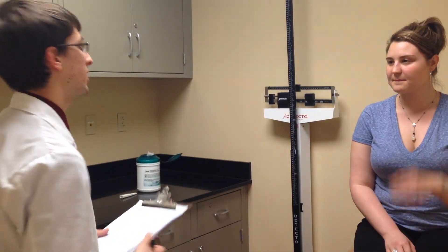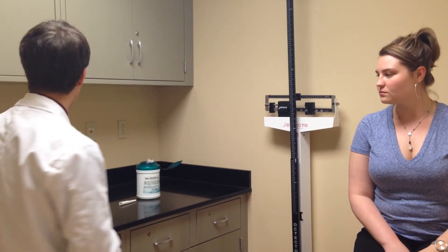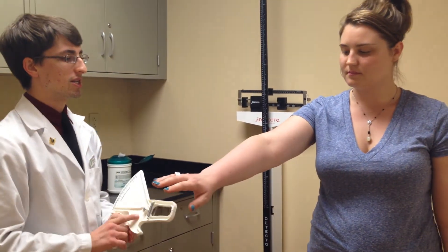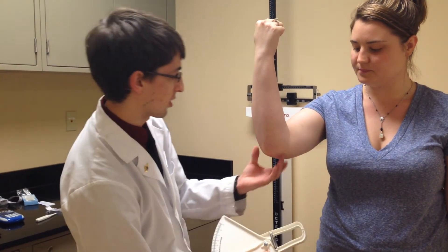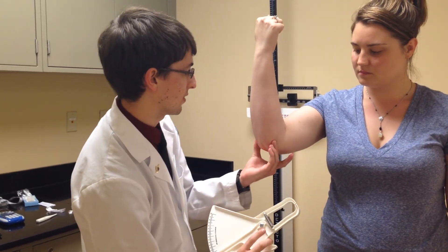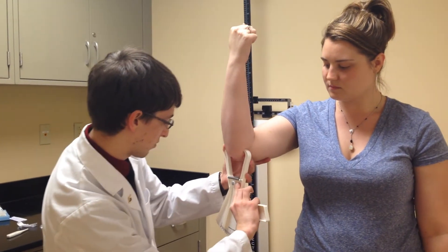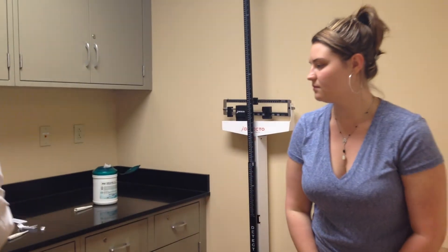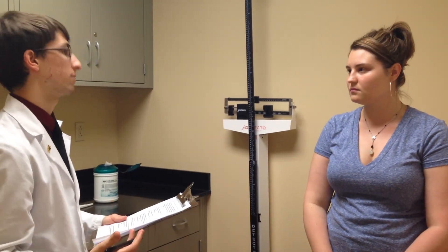What I'm going to do now is measure your elbow breadth, which will give me an idea of your bone frame size — small, medium, or large. Can you stand up and extend your right arm, then bend it at a 90-degree angle? I'm going to locate the epicondyles of your elbow — these bony protrusions right here — and measure with the caliper. That's 63 millimeters, or 6.3 centimeters, which puts you in the medium frame category.